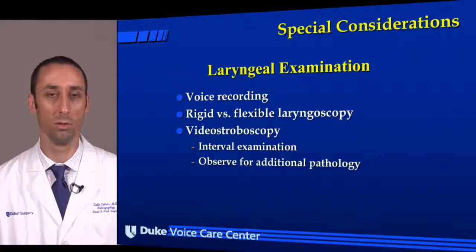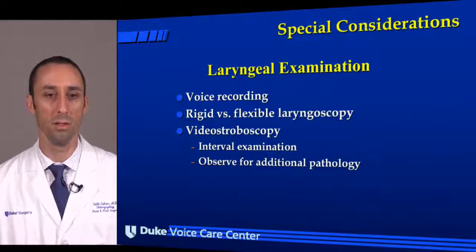So what are we doing? Well, we're going to do a voice recording. The perceptual voice analysis, how they sound, is very important. We're going to do a laryngoscopy, and there's various techniques using rigid and flexible instrumentation. And when we're considering surgery, it's very important to get a video stroboscopy.